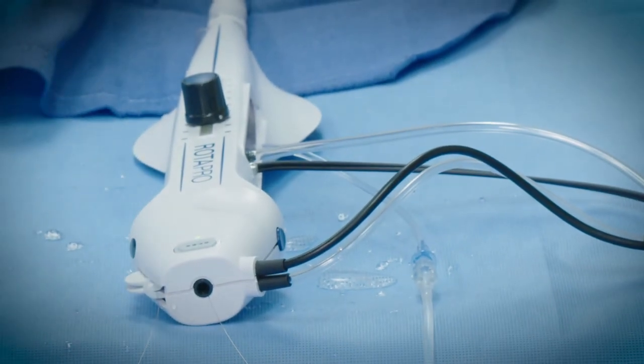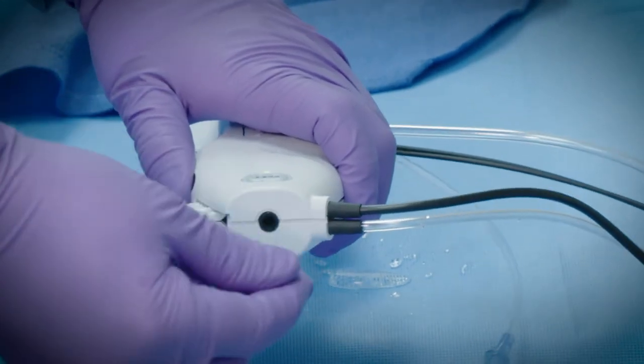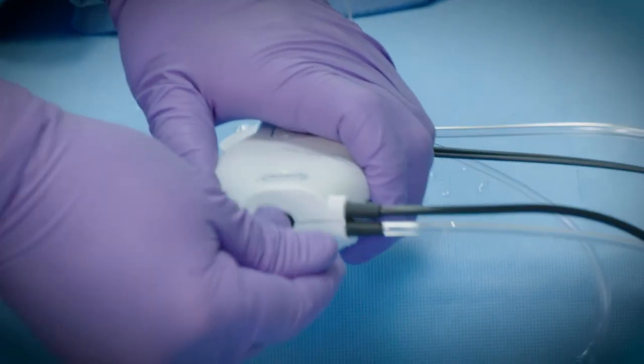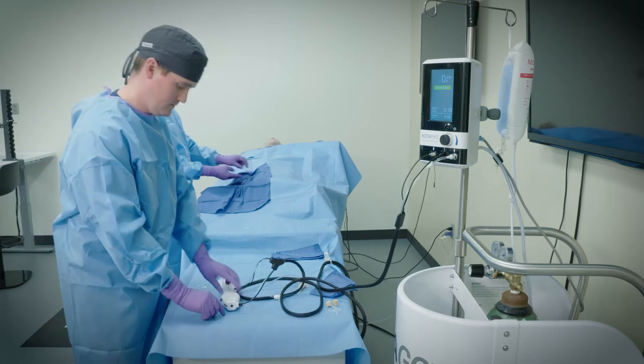Press and hold the DynaGlide momentary button. Under fluoroscopic guidance, withdraw the burr over the guide wire. Release the DynaGlide momentary button once the burr is out of the guide catheter.